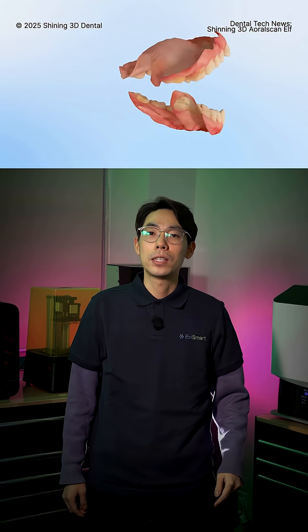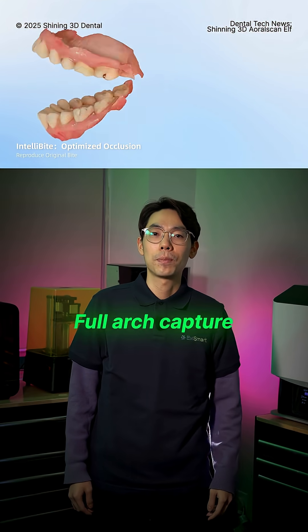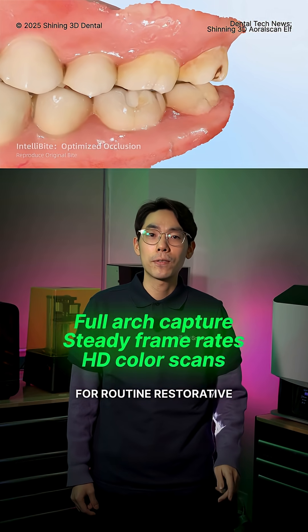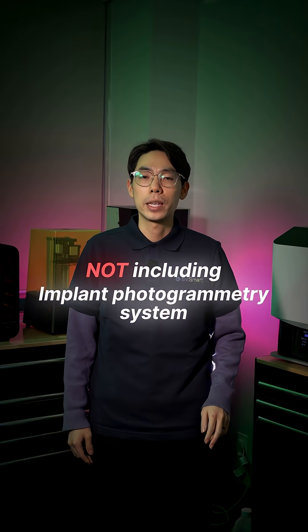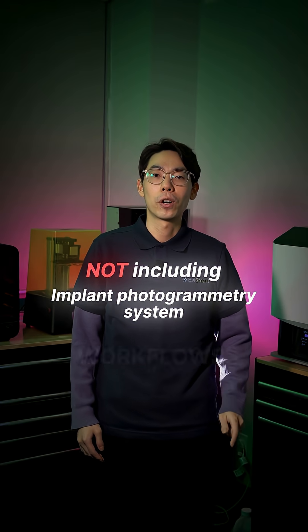Scan performance is built on the same engine used in the AeroScan Elite. You get quick full arch capture, steady frame rates, and high-definition color scans for routine restorative, aligner, and diagnostic work. What it does not include is the implant photogrammetry system that the Elite uses for full arch implant workflows.